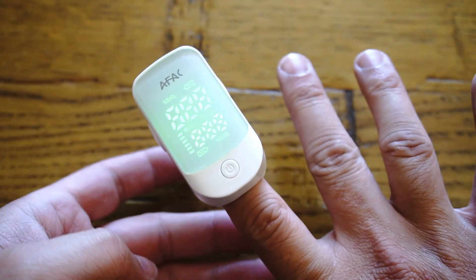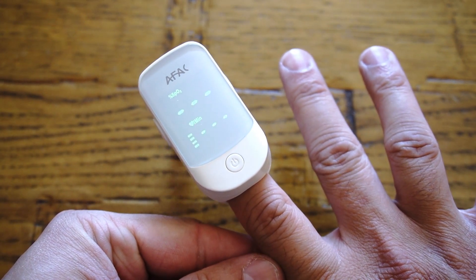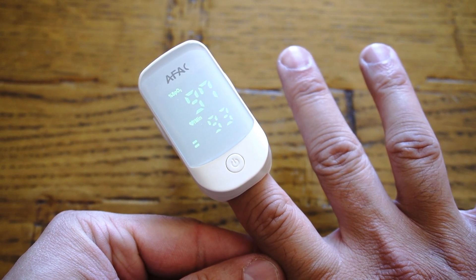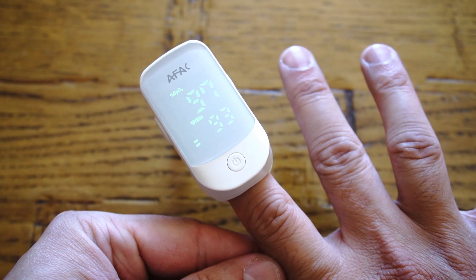All you need to do is clip the oximeter on your finger and click the power button on the top, wait seven seconds, then heart rate and blood oxygen saturation will be shown on the screen with a beating pulse graph as well.